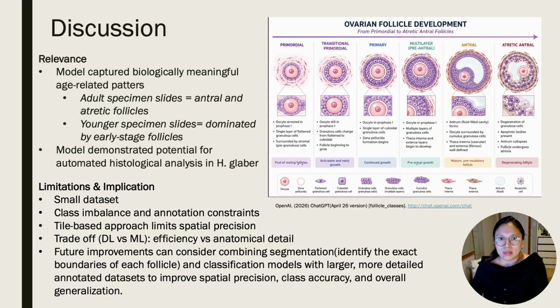than random patterns. For reference, the visual highlights the follicle stages as follicles move from one stage to the next. The follicles with the most complex structures were harder to identify with this study, but were accurately found within the correct slides.